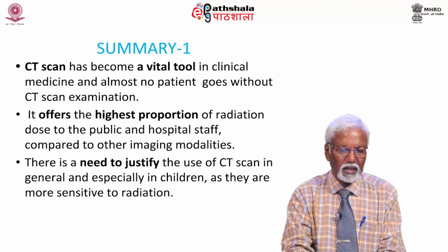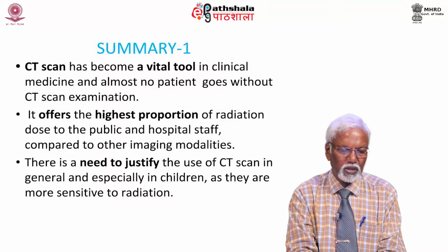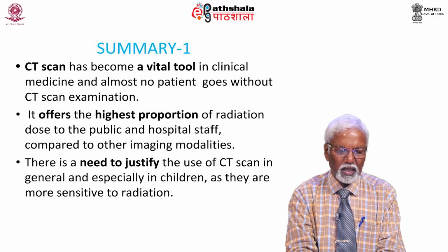CT scan has become a vital tool in clinical medicine and almost no patient goes without a CT scan. It offers the highest proportion of radiation dose to the public and hospital staff compared to other imaging modalities. There is a need to justify the use of CT scan in general and especially in children, as they are more sensitive to radiation.